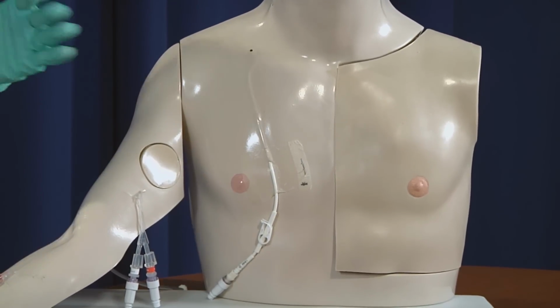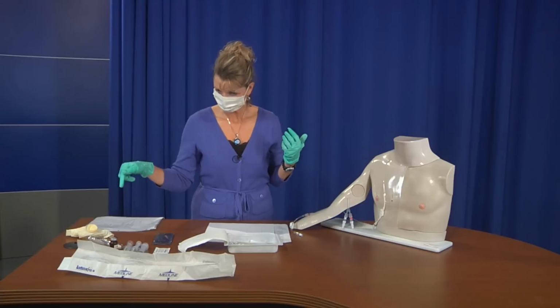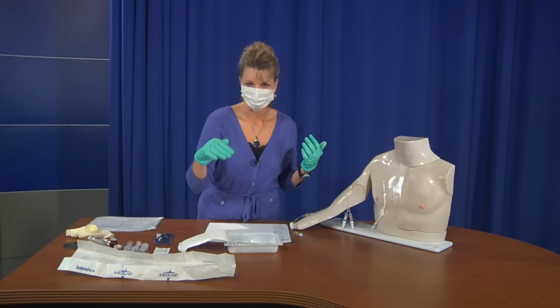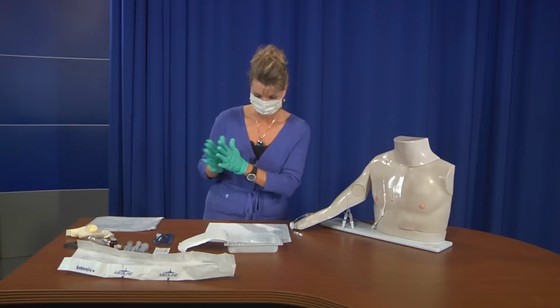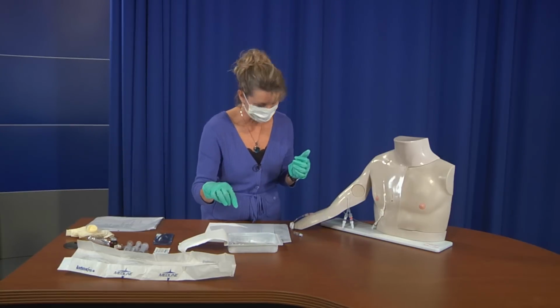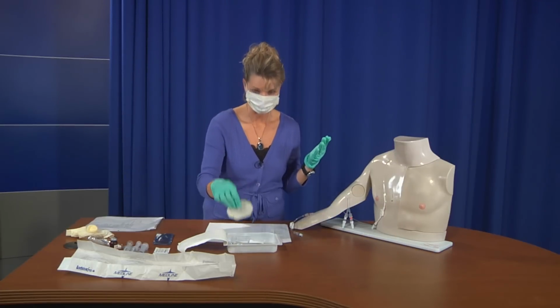Once we do that, we want it to dry. Do not put that back in your tray. Throw it away. Now, if you want to, you can use your sterile glove paper as your trash can at the bedside. So the next thing we're going to do is, after it's dried, we are going to put another opsite on.